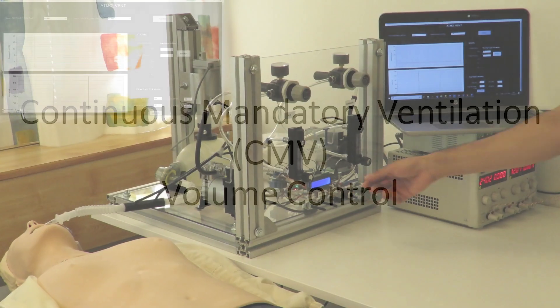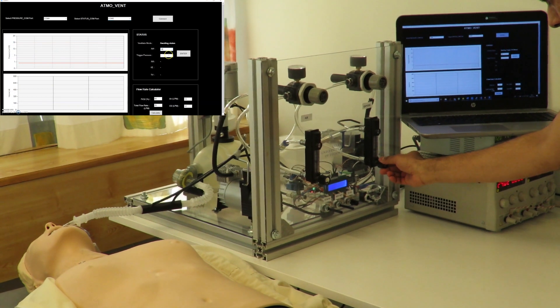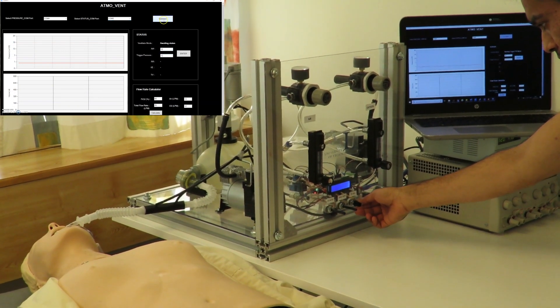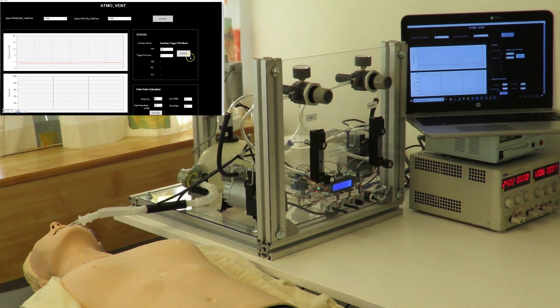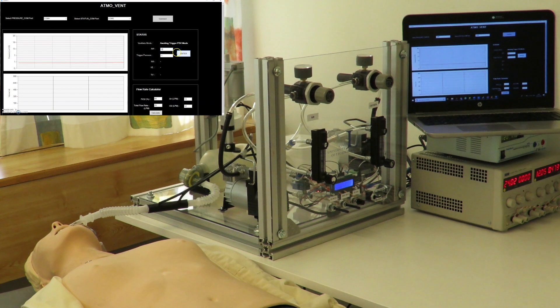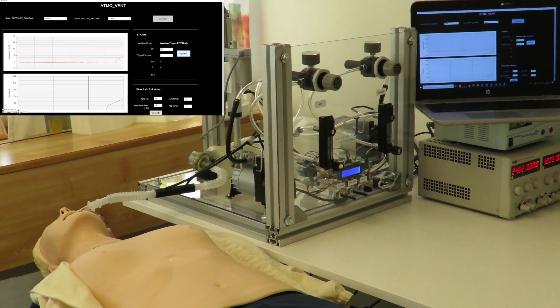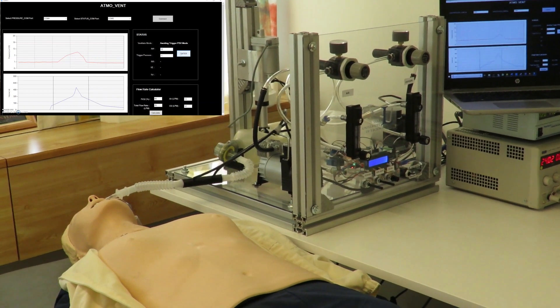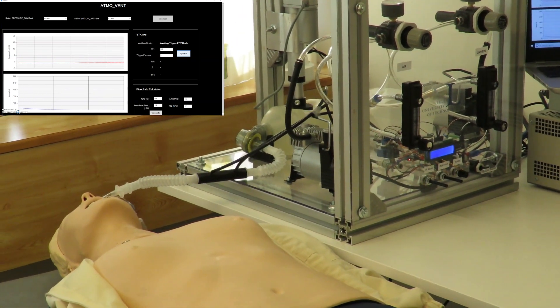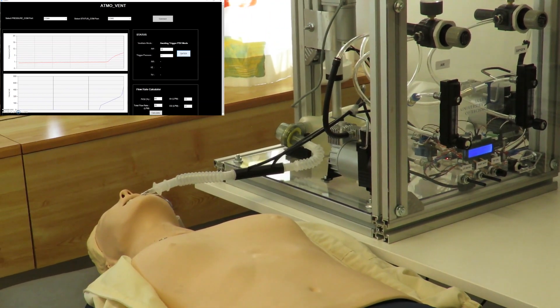The volume control continuous mandatory ventilation mode is commonly used for patients who cannot breathe on their own. Before triggering the mode with the S switch, the tidal volume, respiration rate, and the inspiration-expiration ratio are placed in the control knobs. The ventilator software then converts the inputs into stroke length and speed of the linear actuator to execute the required inhalation and exhalation process. The parameters may be varied during the process if required.